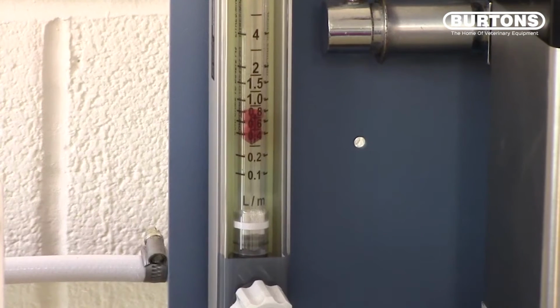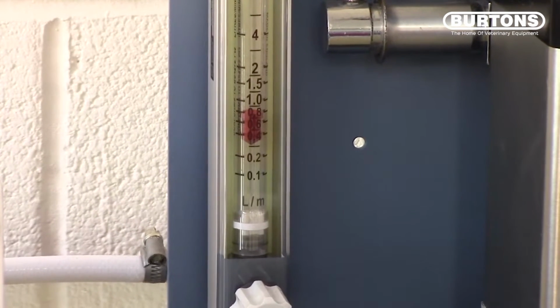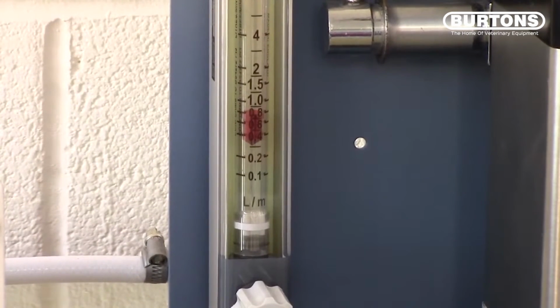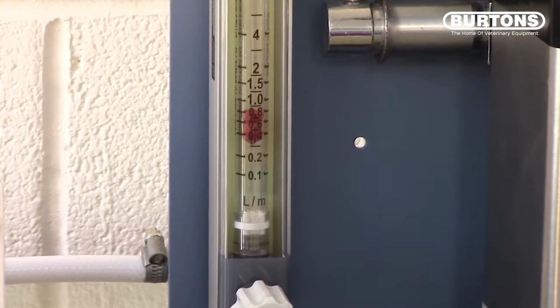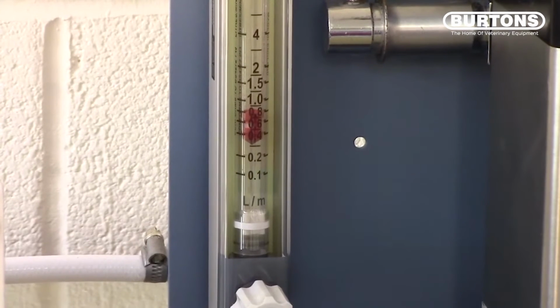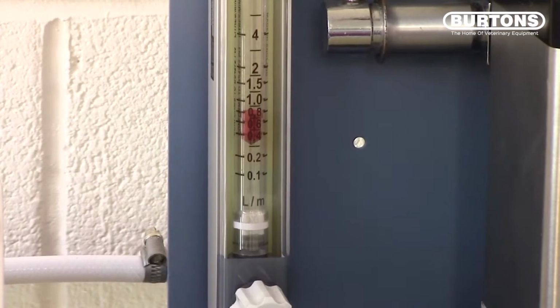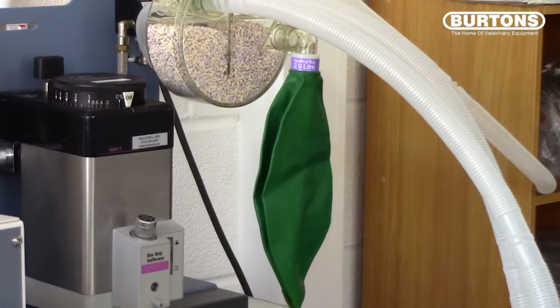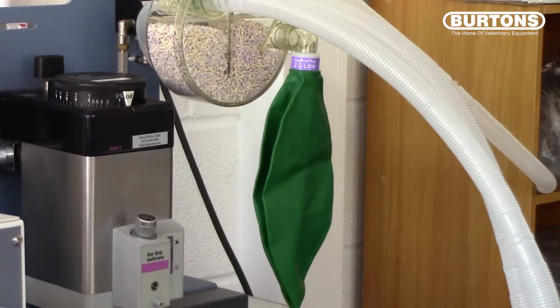In a circle configuration, the fresh gas flow only needs to meet the metabolic requirements of the animal. In practice it tends to be set generally a bit higher than this, and in fact the settings should be the same as you normally use for a circle system in a spontaneously breathing animal. Note the periodic filling of the reservoir bag during expiration. This is quite normal.